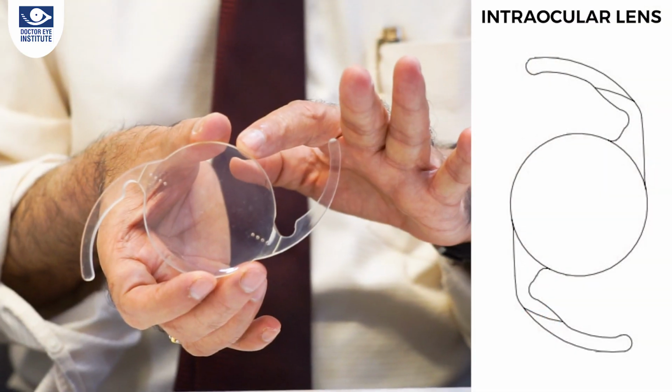About 25 years back, there were no lenses. Okay, that time, what used to happen is we used to remove the cataract, and those are the thick glasses that were given to the patients later on. They were also called soda glasses. Right. So the number then used to be plus 10, plus 13. And now all of that is going inside the eye. So friends, I hope this clears your doubt about what IOLs are. Let me show you a prototype for demonstration purposes.